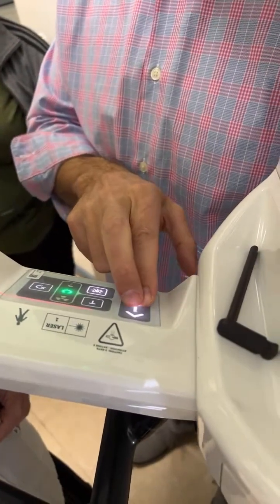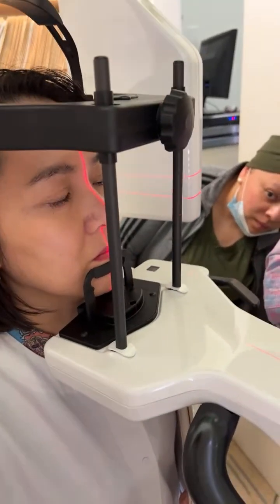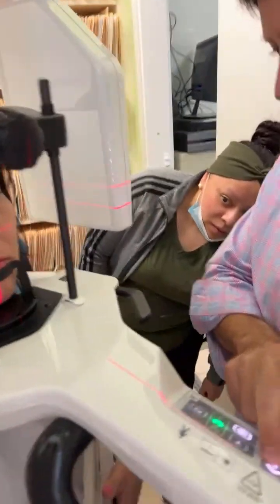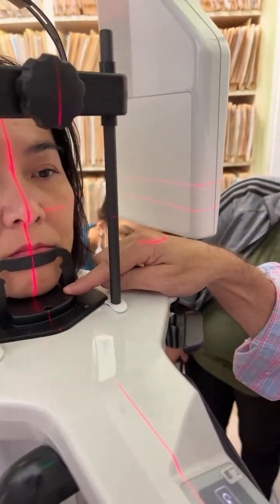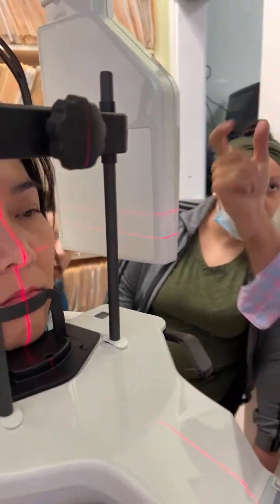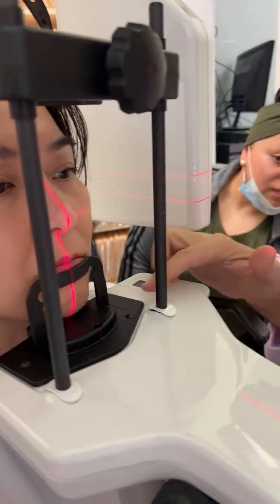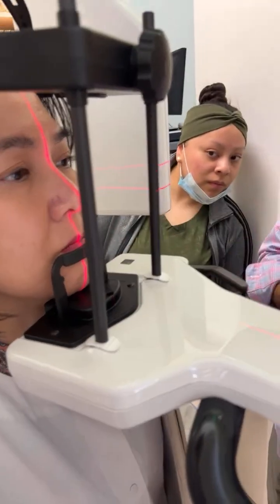I'm going to move this up. Look at the lights go up her face. See how they're going up higher and higher? That's because we have the space under here. If this was turned the other way, that plastic piece would be in the way, wouldn't it? You couldn't move it up. That's why the engineers designed it this way. It's very smart.